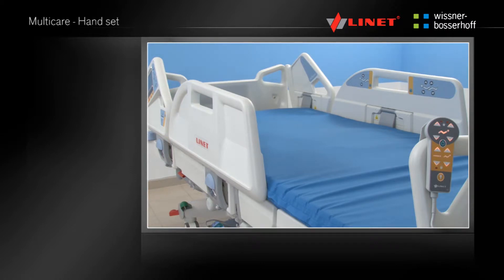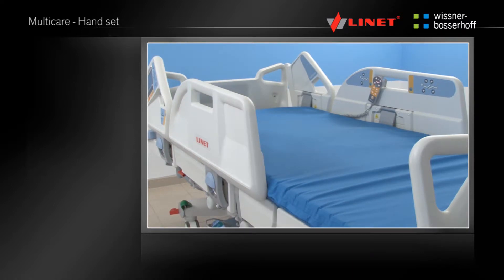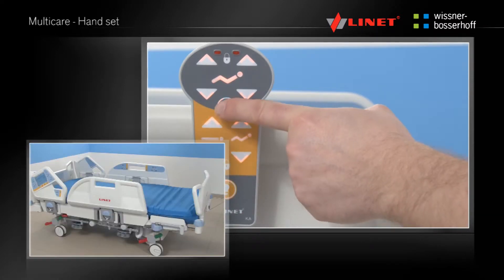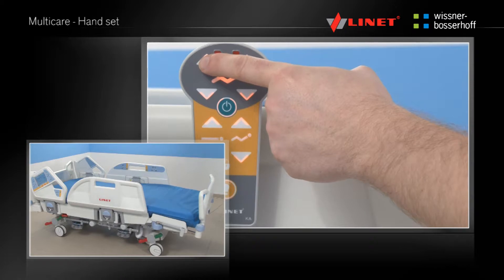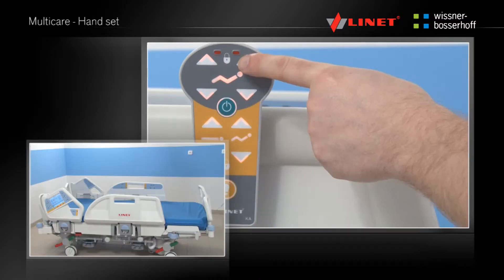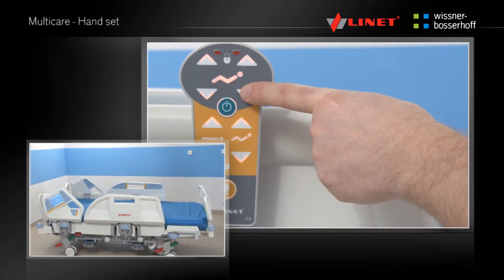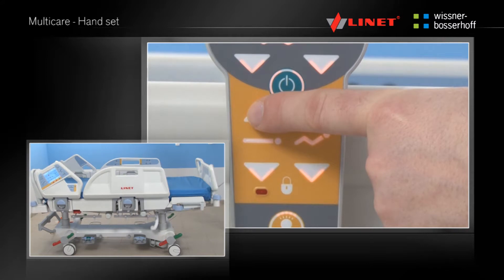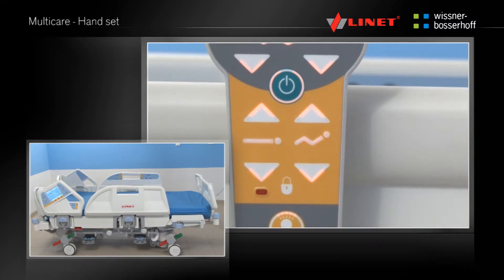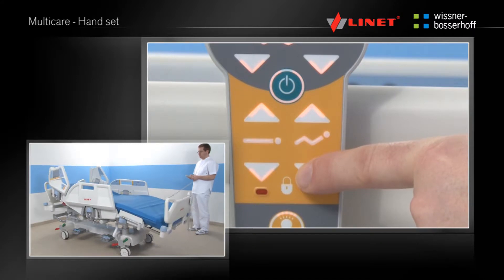The ergonomic handset can be hooked along the side of the bed or over the side rails. The handset can be used by the patient or staff. The spiral cable provides good range and flexibility. Before using any function, press the Activation Go button. The handset provides the user with the thighrest and backrest positioning, as well as the height adjustment buttons and buttons for simultaneous positioning of the thighrest and backrest — auto-contour.